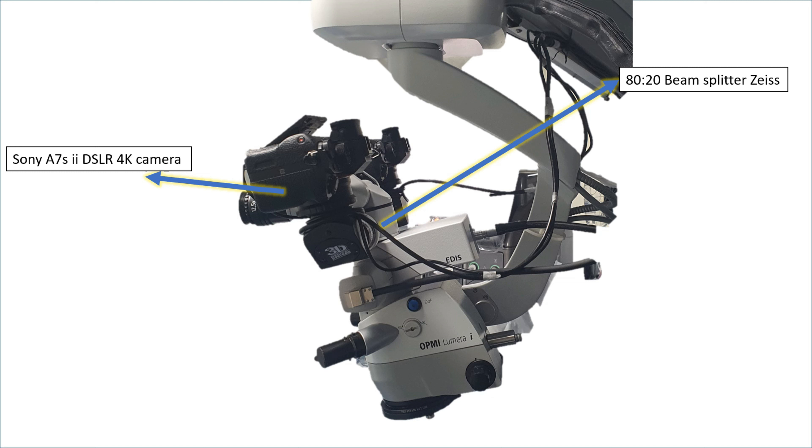Below the microscope there is the external data injection system (EDIS) of the Calistoi. The Sony A7S2 camera is recording through the beam splitter of EDIS as well, so it will also capture the overlay which the surgeon is going to see.